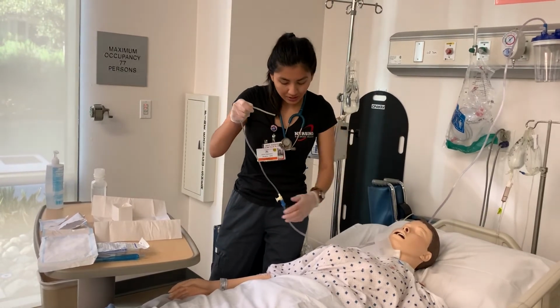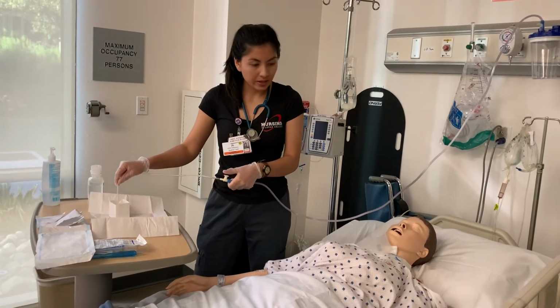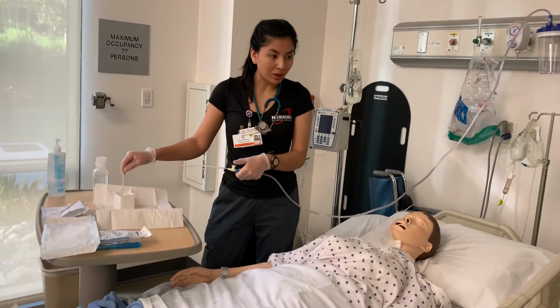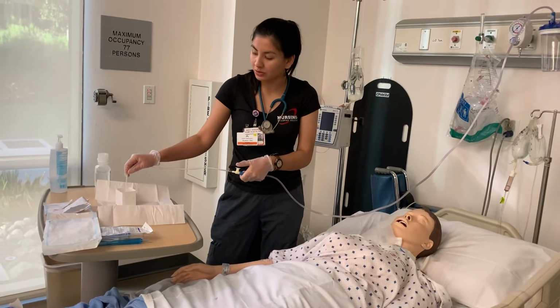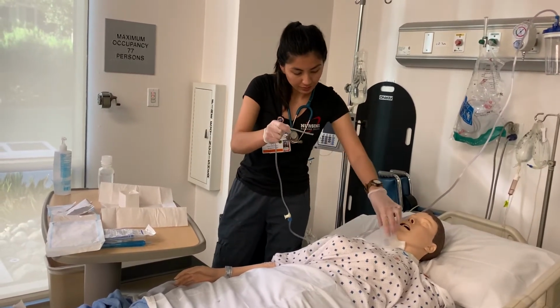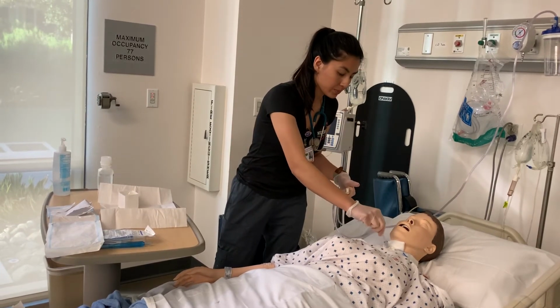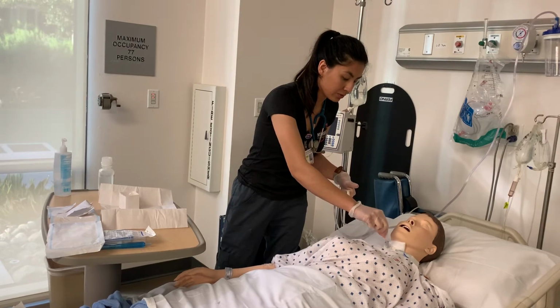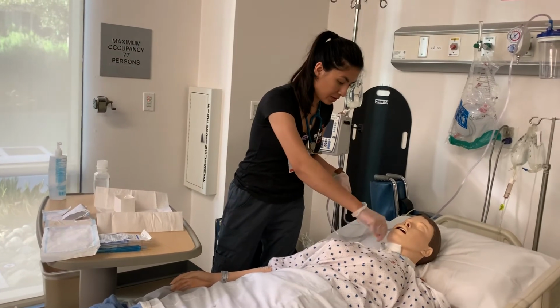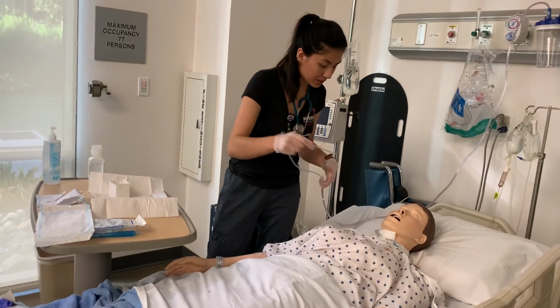All right, Jane, can you go ahead and take some deep breaths for me? Cough if you need to. And then as I'm doing this, I would be watching her O2, making sure that her O2 saturation looks good. And then I come back over here. I'd insert until I meet resistance and she coughs. I'd ask her to cough. Thank you. And then I would intermittently suction for 10 to 15 seconds.